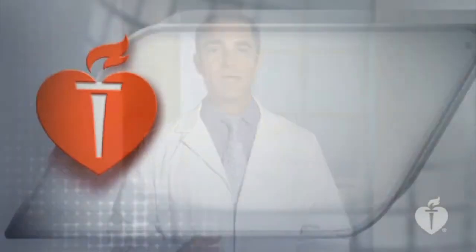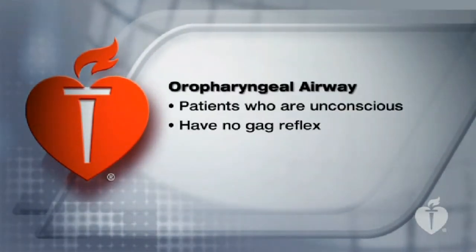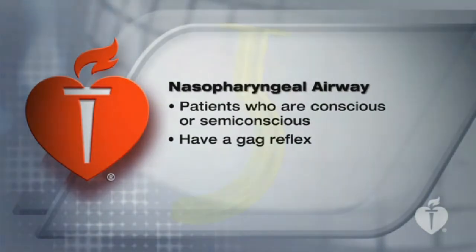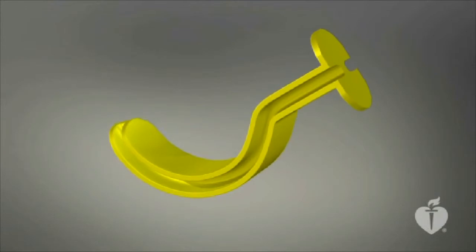There are 2 main types of airway adjuncts: the oropharyngeal airway, or OPA, and the nasopharyngeal airway, or NPA. OPAs are commonly used for patients who are unconscious and have no gag reflex. NPAs may be used for conscious or semi-conscious patients who still have a gag reflex. The OPA is a J-shaped, single-use, disposable plastic device.